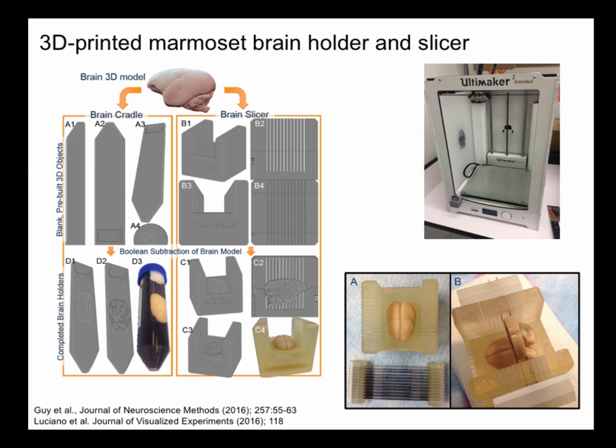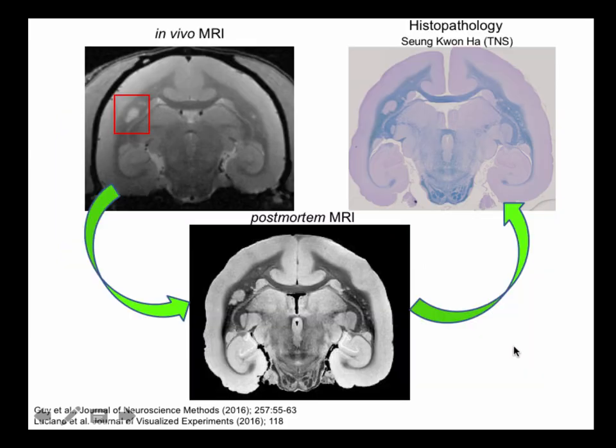And we have developed expertise in our lab through two very good students, Joe and Nick, who have been helping me really build up a 3D printing imaging program where we basically design our own brain holders and brain slicers so that we can carefully cut slabs of tissue where we want to get the lesion. And there's a whole pipeline involved in this on the MR side.